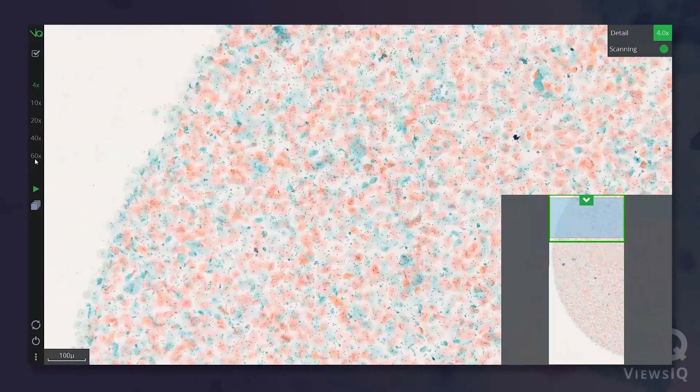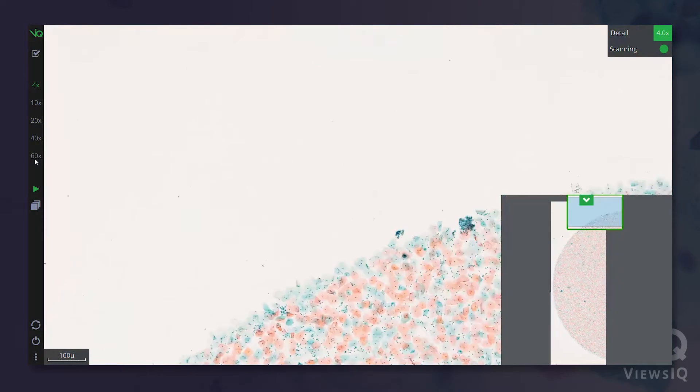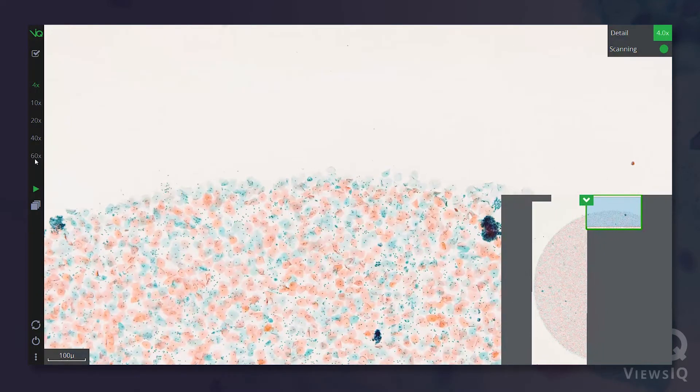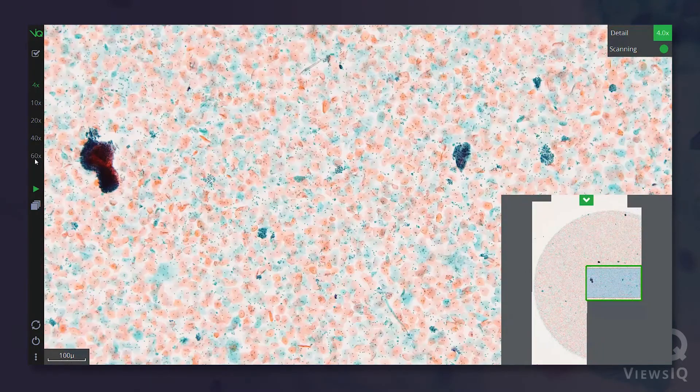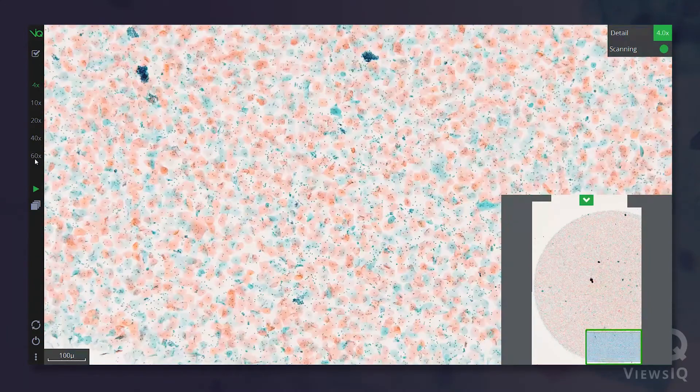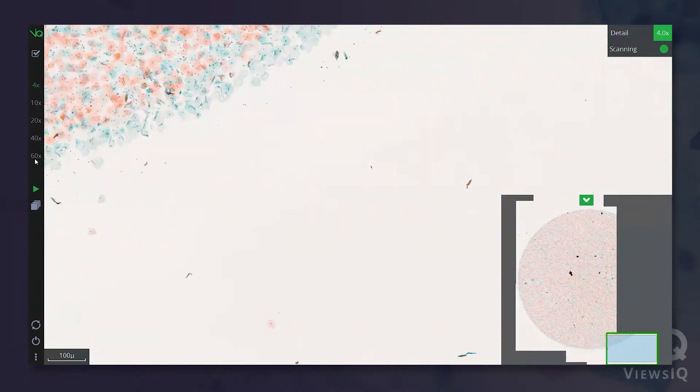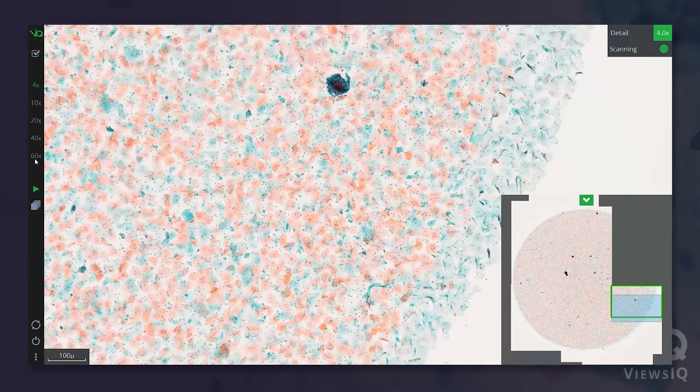As you move the slide around, you can see Panoptic records in real-time what you've seen. Up, down, left, right, doesn't matter. Panoptic simply incorporates new areas as you view them, just as you would survey a slide normally.